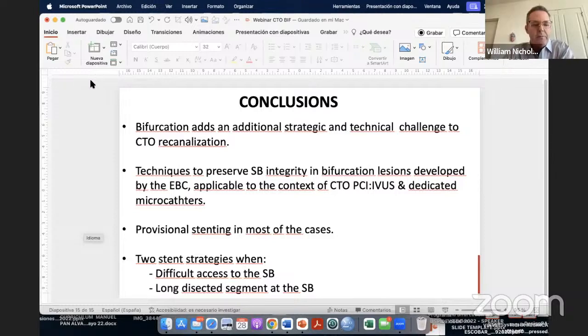Let me ask you with that, if you go to a 2 stent strategy, which oftentimes when you have these scenarios, what I'm describing, where you do have a flap that you've had to overcome, and you are successful wiring both now, and you've ballooned both with kissing balloons to prepare it, and then you decide that you're going to need 2 stents. Do you have a rule of thumb or a way that you approach, one, what's your stent strategy, and 2, what do you treat first, knowing that you're going to have to rewire through the stent into the other branch? I read your article, but I didn't know whether or not you talked about what 2 stent strategies are employed most frequently.